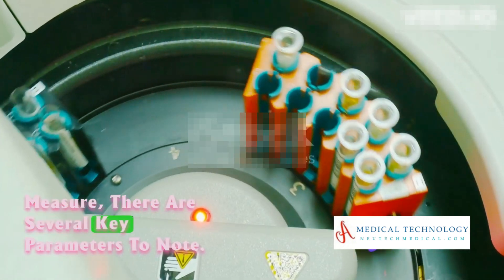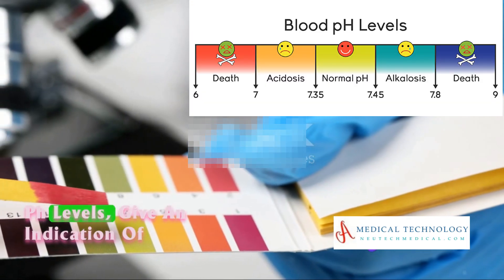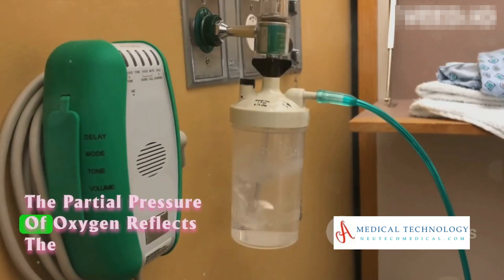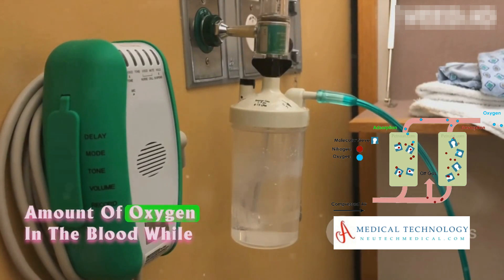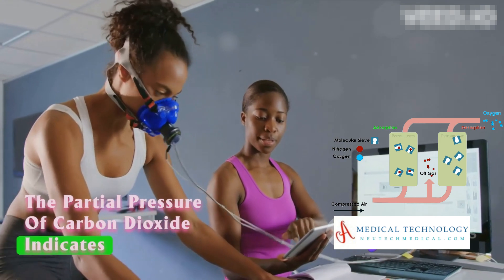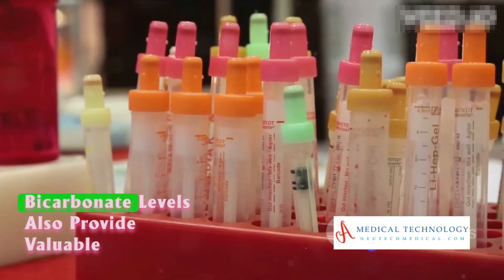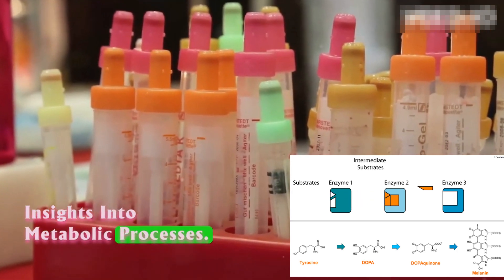When it comes to what exactly these analyzers measure, there are several key parameters to note. pH levels give an indication of the blood's acidity or alkalinity. The partial pressure of oxygen reflects the amount of oxygen in the blood, while the partial pressure of carbon dioxide indicates how efficiently carbon dioxide is being removed. Bicarbonate levels also provide valuable insights into metabolic processes.